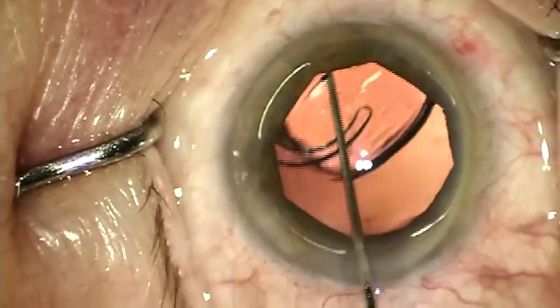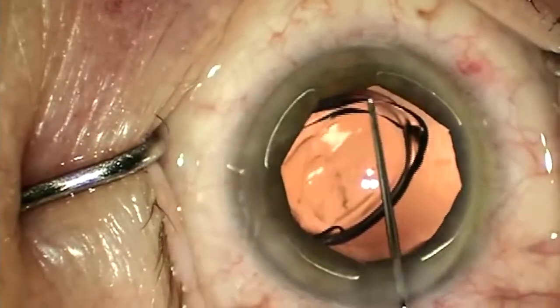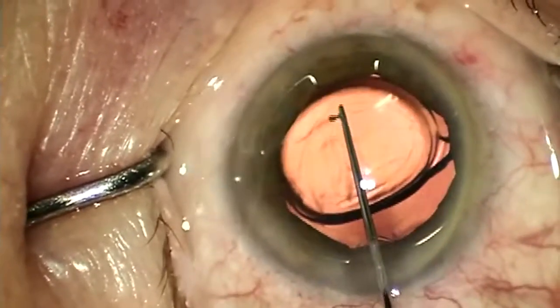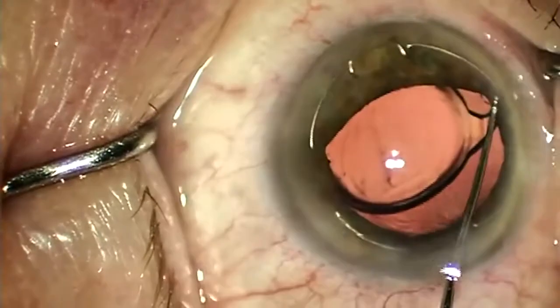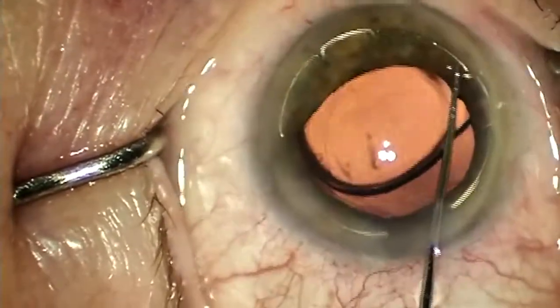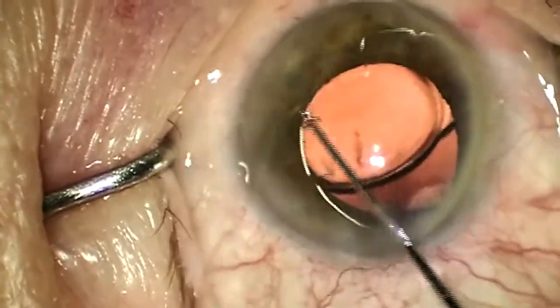Once the lens is safely in position, I disengage the distal hooks, the side hooks, and lastly the proximal hook. I'll invert my Lester hook, snag the proximal hook, and drag it out through the incision. Using the forceps I pull the ring out of the anterior chamber following the contour of the sclera posteriorly.